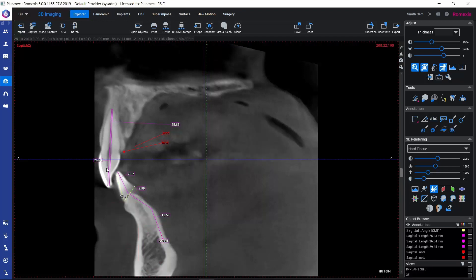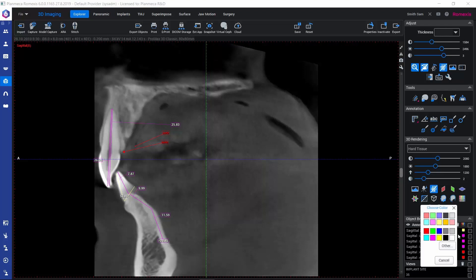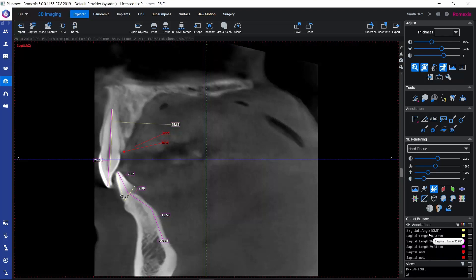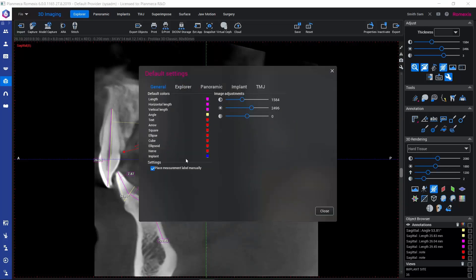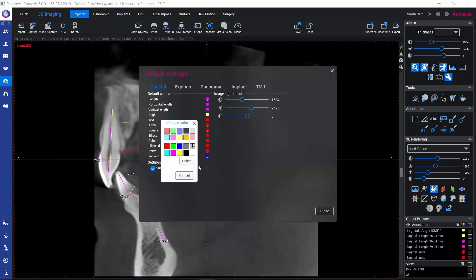If we would like to change the color of annotations, we can use the color boxes next to each annotation and select a new color. If we always prefer annotations in a specific color, we can define default colors in the default settings by clicking on the respective color box for each annotation type.